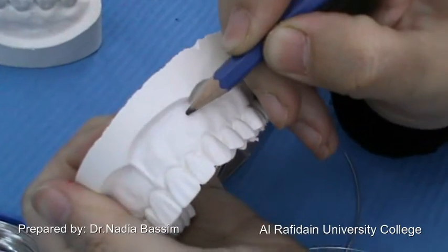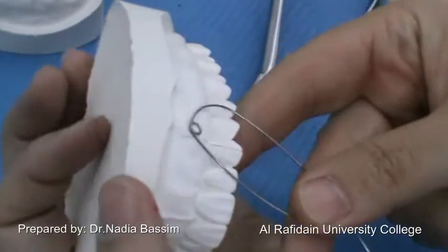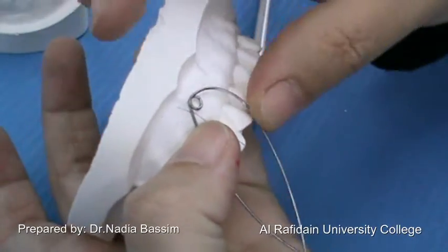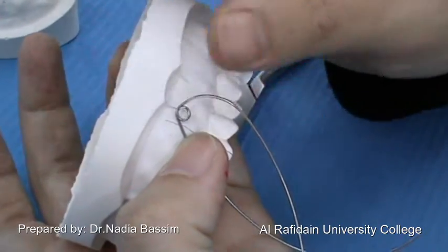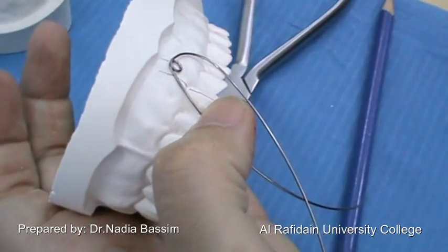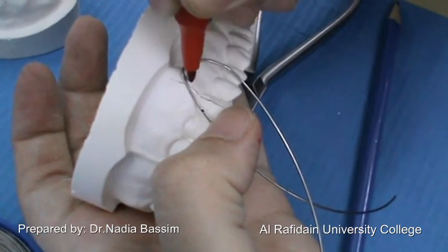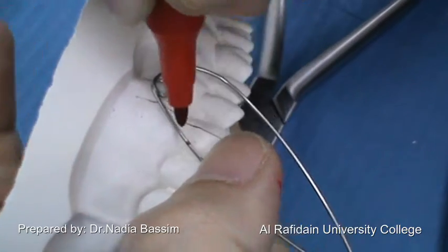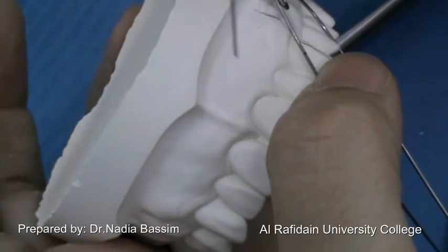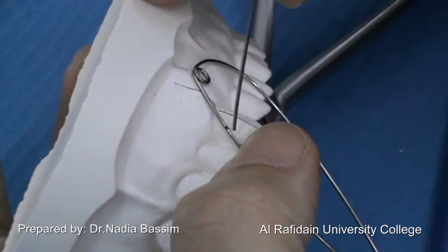I am going to point out the long axis of the canine. The coil should be located distal to it, 2 mm away from the buccal vestibule, distal to the long axis of the canine. This is the position of the end of the medial arm, which is going to end with a small non-traumatic end that enters into the interdental area.